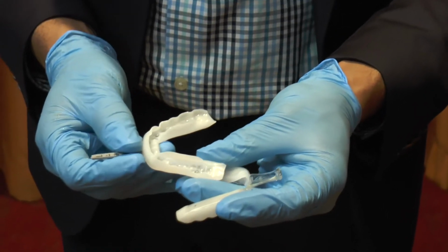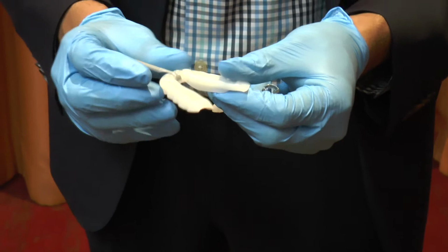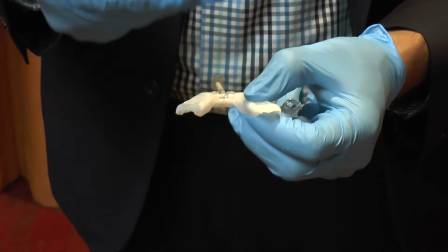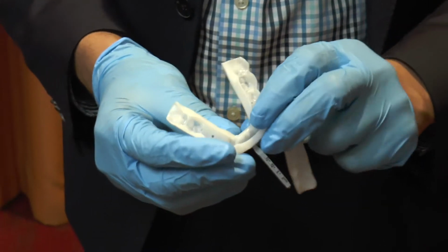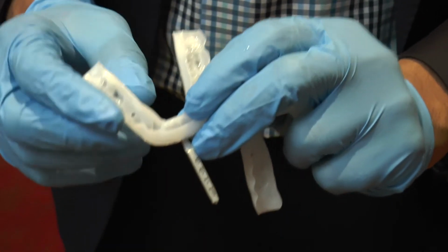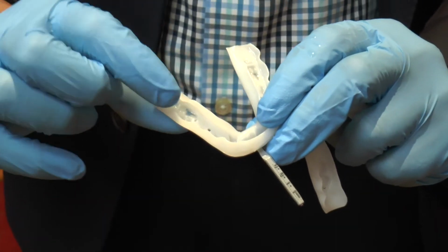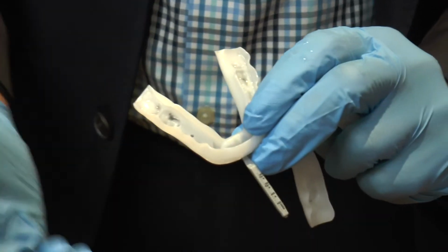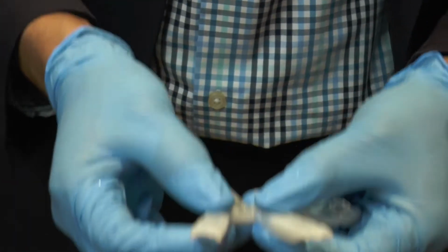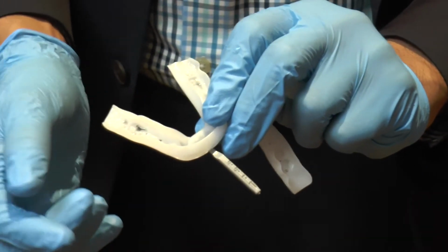So a few tips and a few concerns. When this material is softened and when you take the lower tray into the mouth, as pointed out earlier, you want to make sure that the patient lifts their tongue up. The reason for that is this lingual wall right here. If they don't lift their tongue up and you set this device in, there's a tendency of this lip or flange to roll over. Now if that were to happen, this being a thermocryl material, if you place this back in warm water, you can actually tease it back and then reset it back in the patient's mouth.